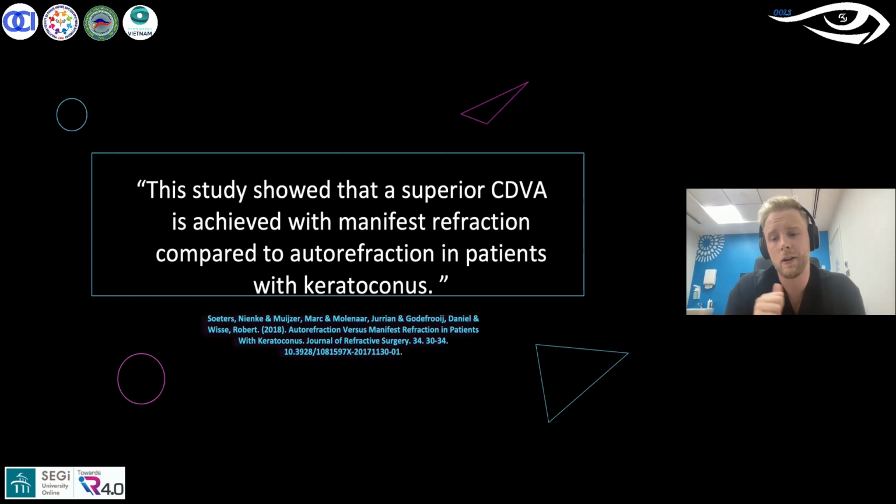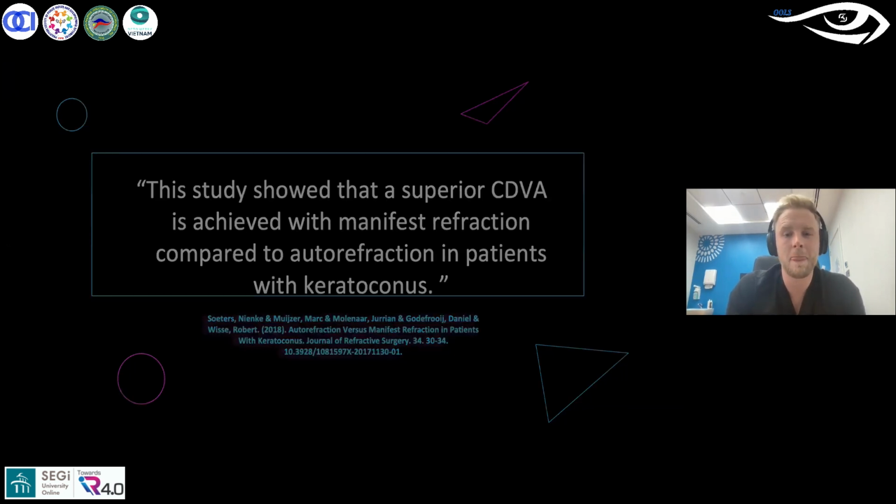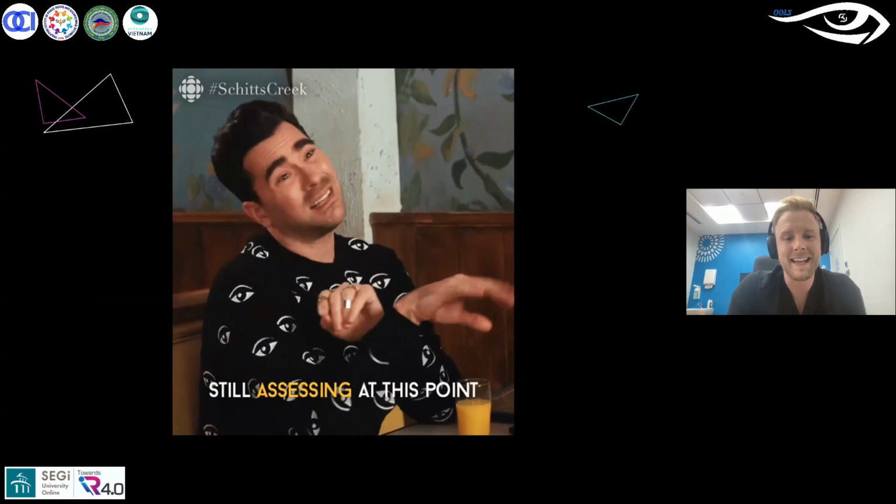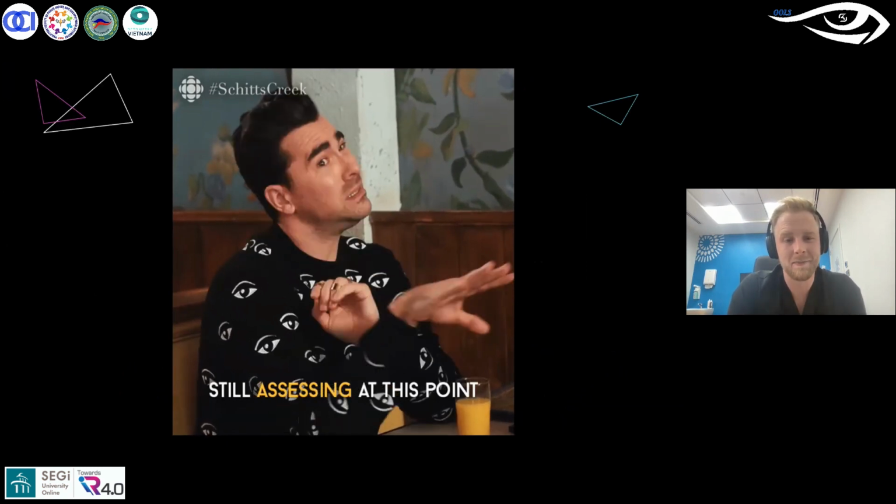Now, I know that a lot of patients, the second you've taken away the autorefractor, want to know, okay, what's my number, or how good's my vision? And you need to just make them aware that we're still doing a lot of assessing at this point, okay? This is definitely not the final result, okay?